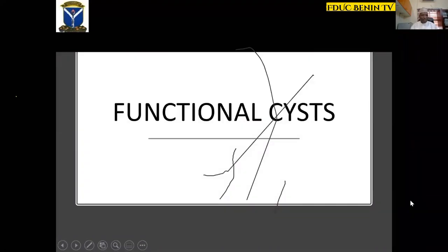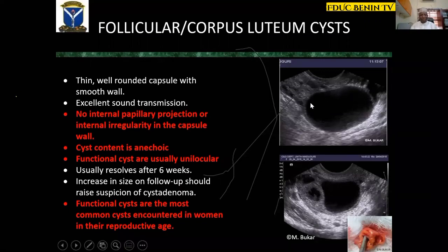Functional cysts are the commonest cysts encountered in clinical practice and will resolve spontaneously without any intervention. In the majority of cases, they disappear within six weeks. They usually have thin walls and clear content with very good sound transmission. This is a corpus luteum with a follicle beside it, and within the corpus luteum you can see some echogenic areas representing luteal cells. This is a rare appearance of corpus luteum appearing as a double follicle.